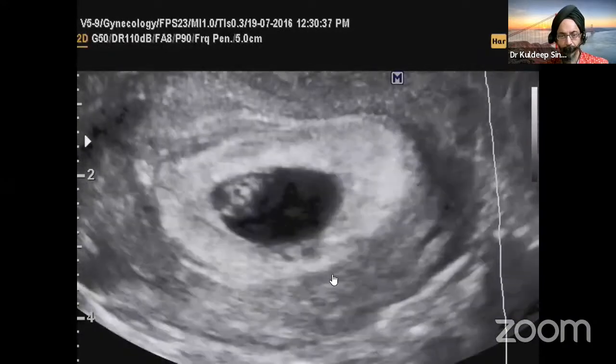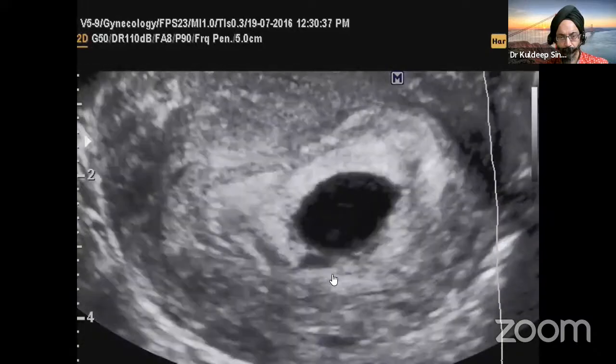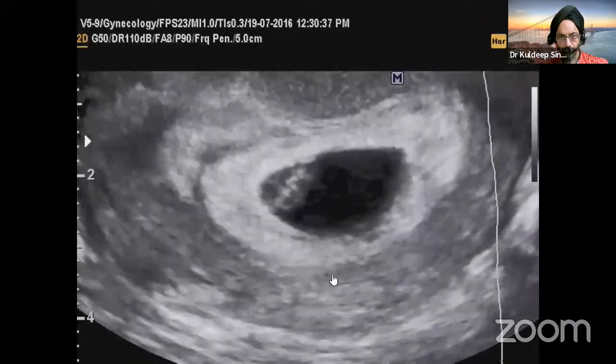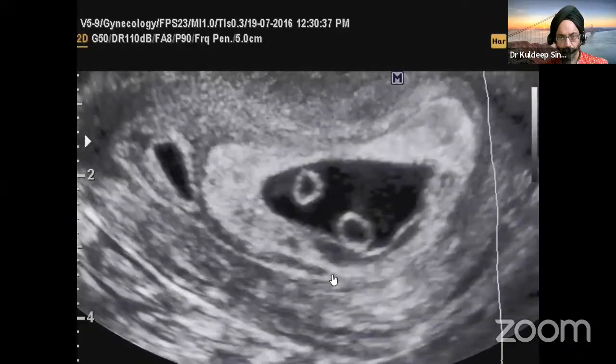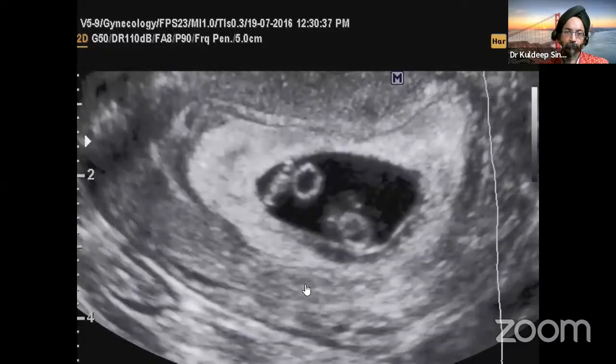Right. How many gestational sacs? We're looking at a single gestational sac. How many yolk sacs in the gestational sac? We're looking at two yolk sacs.